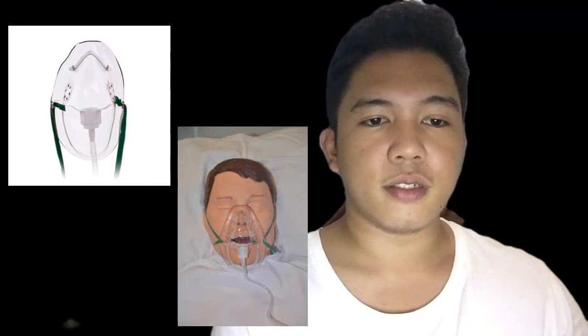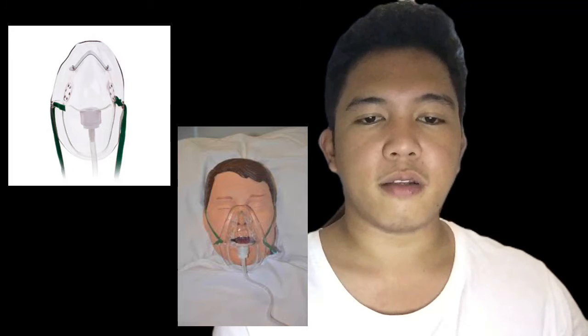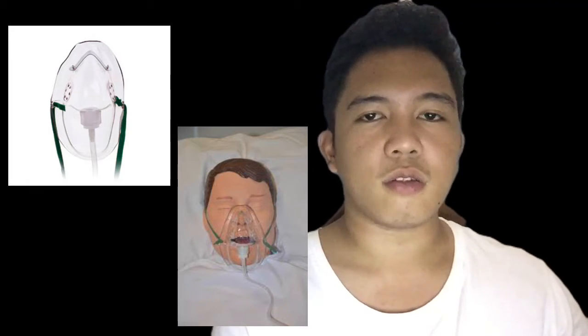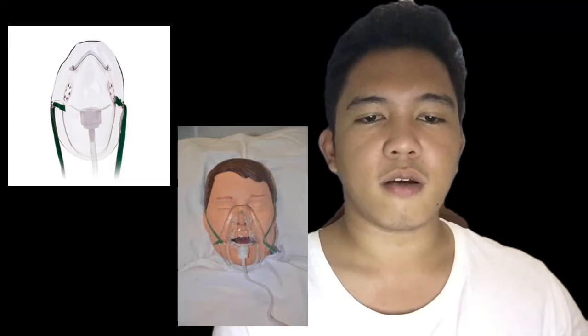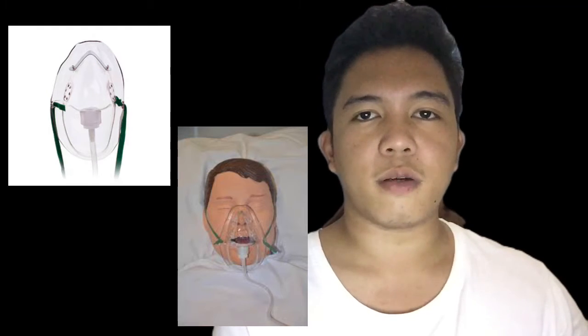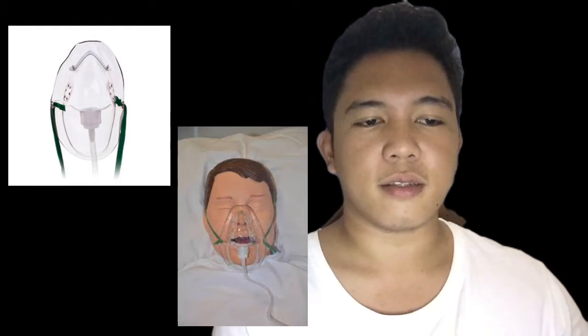The final oxygen concentration delivered by this device is dependent upon the amount of room air that mixes with the oxygen the patient breathes. The general oxygen concentration is between 35% and 50%.